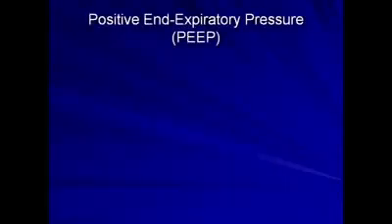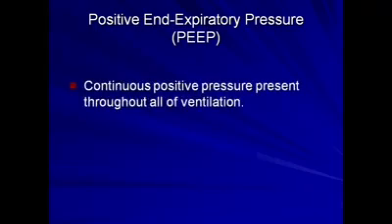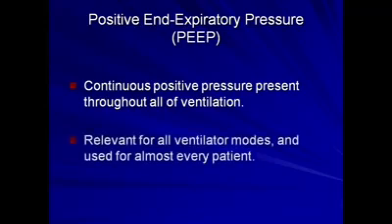Positive end expiratory pressure, usually referred to as PEEP, has been mentioned multiple times in the lecture series so far. Although conceptually simple, in practice it is actually a surprisingly complicated aspect of ventilation. In the basic sense, it is a continuous positive pressure present throughout all ventilation. It is relevant for just about all ventilator modes and pretty much in all circumstances.